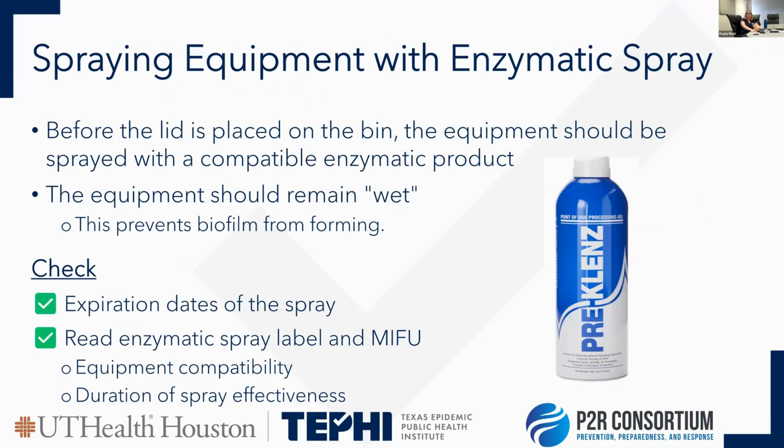Next, before they put the lid on, you want to make sure that you're seeing the enzymatic spray. Also ask the staff how long the enzymatic spray is on, and make sure they are spraying enough that it stays wet. You can look at the expiration dates. When was it opened? When does it expire? And how long is the duration?